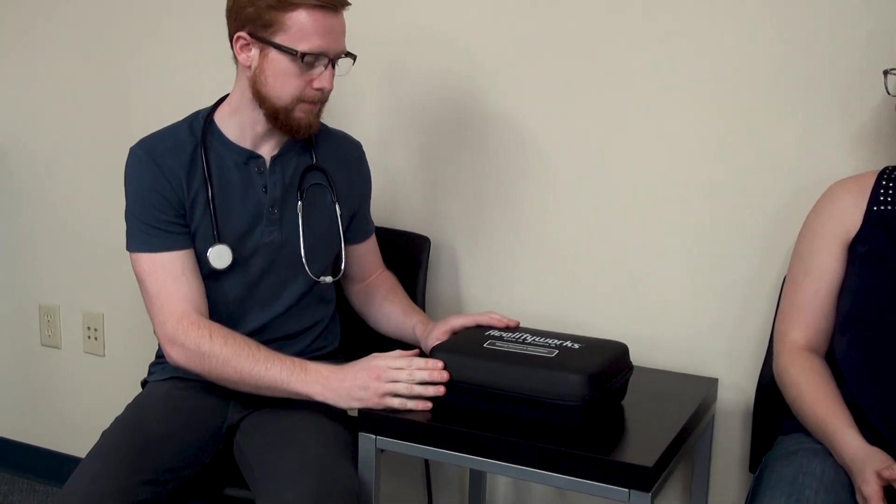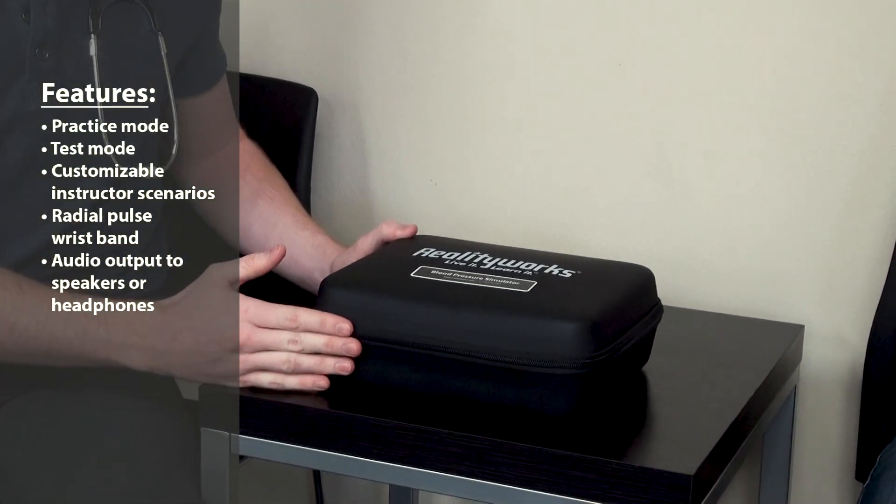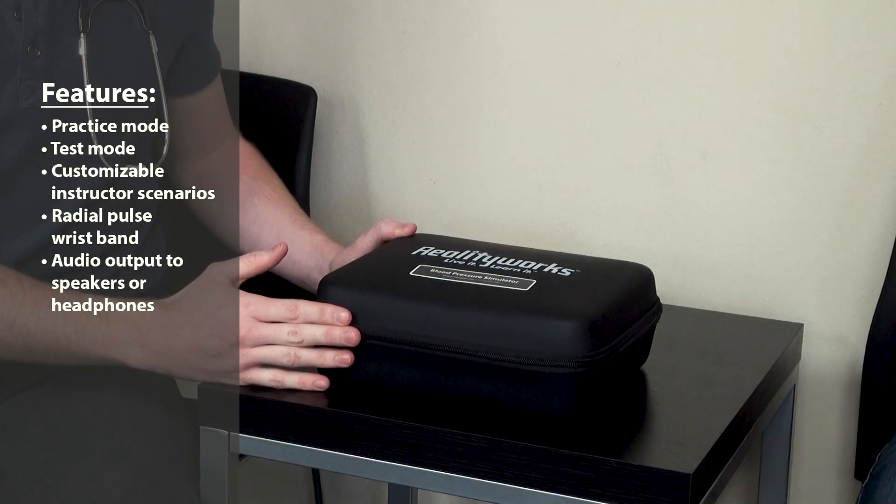This is the blood pressure simulator that we've developed here at RealityWorks. The device is intended to teach proper blood pressure measurement techniques for students in the classroom or healthcare simulation settings. We've created it to be different from other simulators on the market to provide a more realistic and engaging experience for the students.